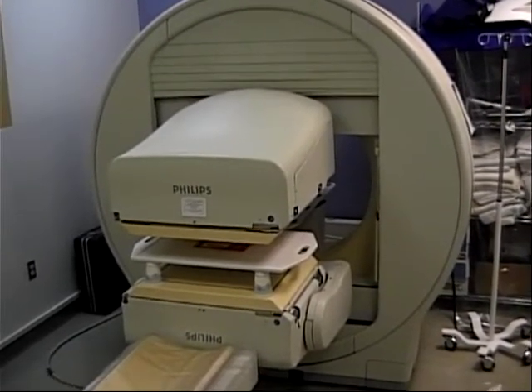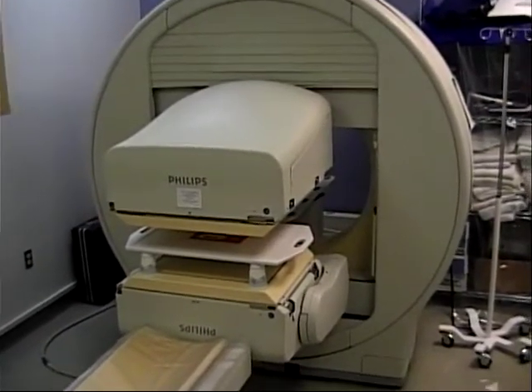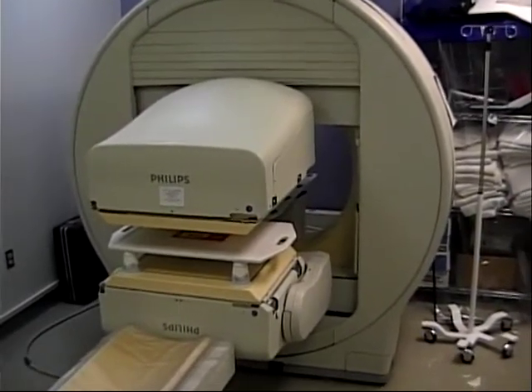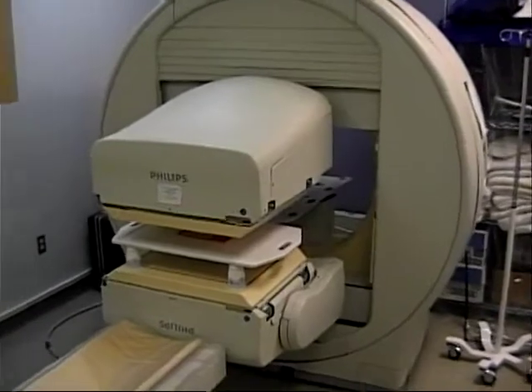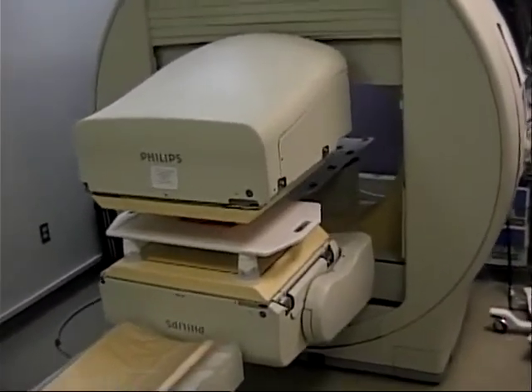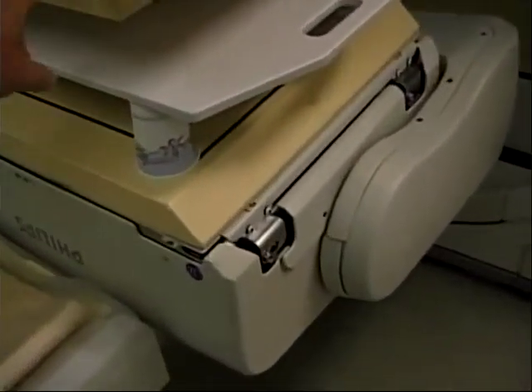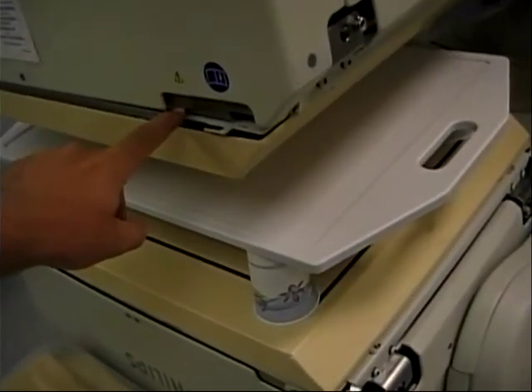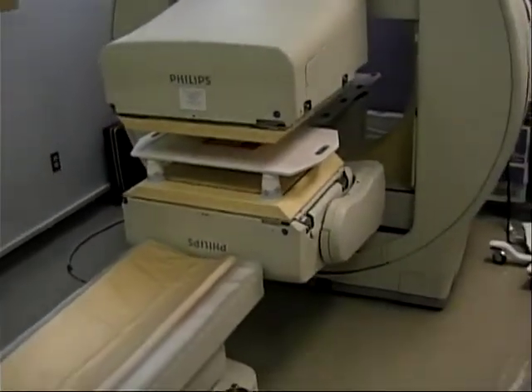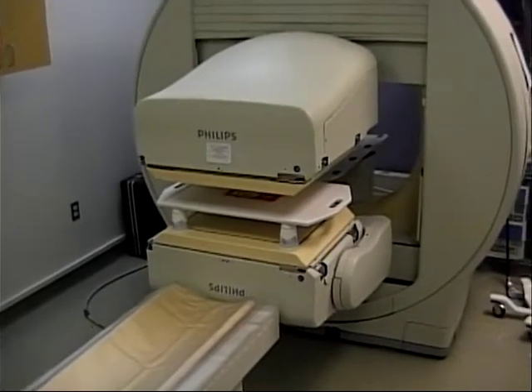Alright, today we're going to talk about one type of QC that we can do with the gamma camera that involves moisture getting into the crystal of the actual camera heads. Now those crystals, which are located right here just beneath the collimators, which are right here. These are the collimators, the crystals just underneath it. The crystals are hygroscopic, which means they attract water.